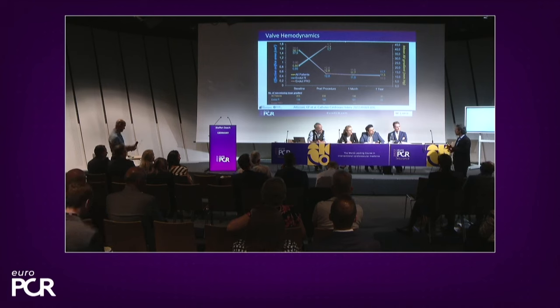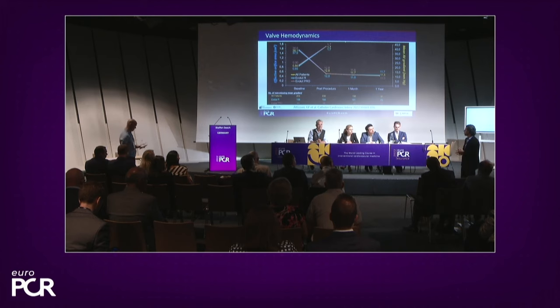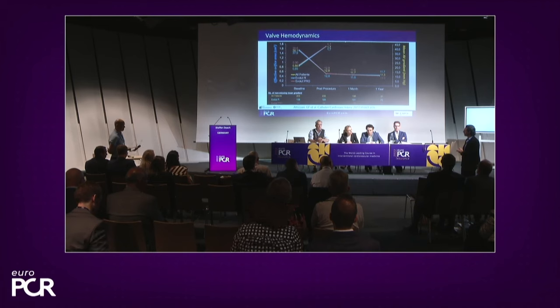First, I think cerebroembolic protection is a must. Second, you saw how he was pushing forward and there was a bit of resistance crossing this valve. Do you suggest that we pre-dilate? Is there a risk of breaking off a piece, because the same way as you're pushing, you can tear a bit of a leaflet? Is it maybe safer and less traumatic to do a balloon? And the second question is on positioning. Any tips and tricks on how to position these valves? Is that more or less difficult than a native valve, or the same?